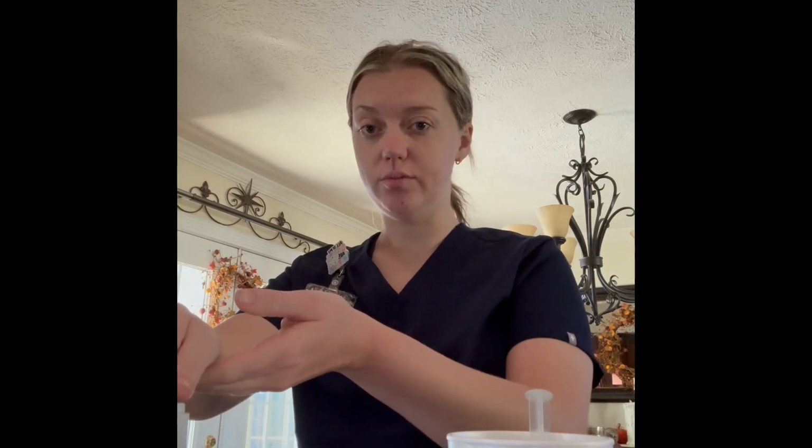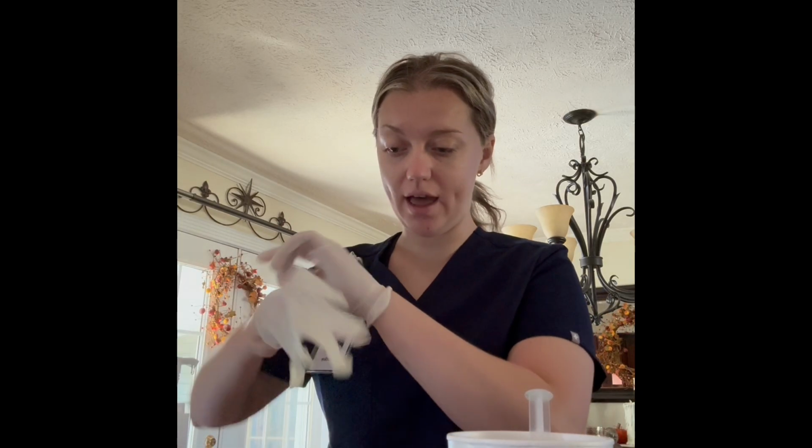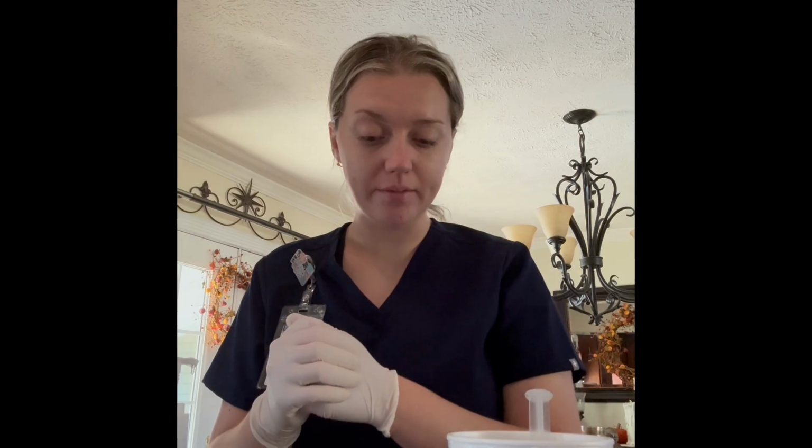So I'm going to perform hand hygiene and then don gloves. I'm going to be performing all 3 injections, and then I will complete the steps following the injections only one time. That way I can show without having to repeat all of the steps several times.